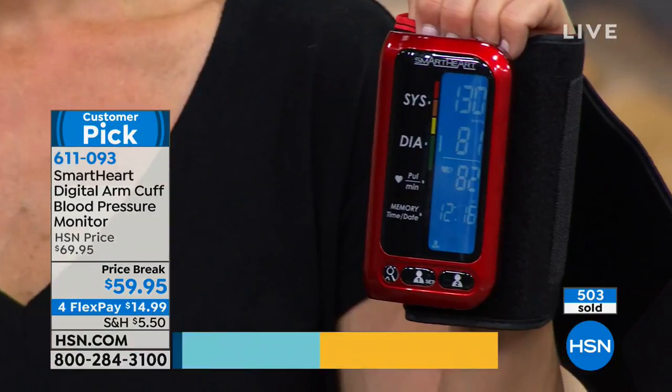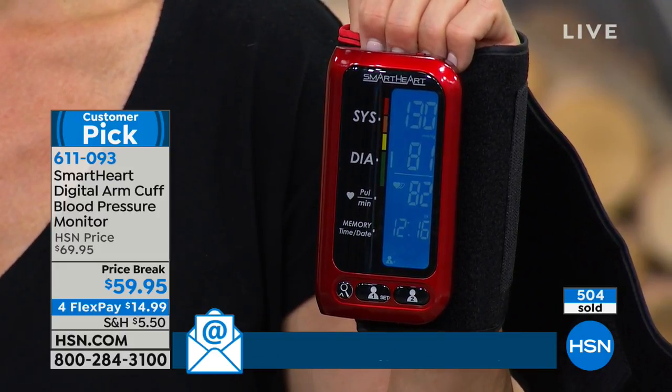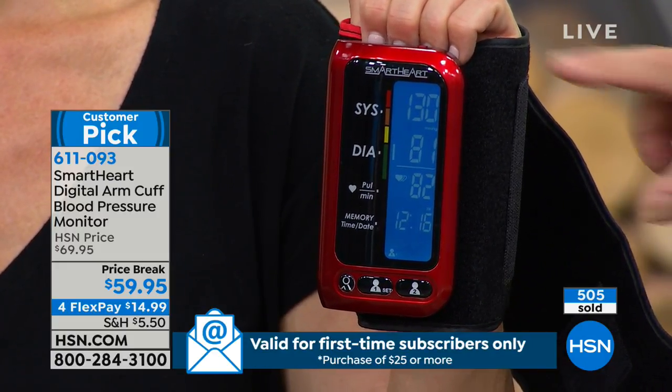When I was reading the reviews, people said things like, 'I like it that I could just take the unit to my doctor and show them what my readings are during the day.' There's something called white coat syndrome, which means you go to the doctor and you're so nervous your blood pressure goes up. So you're not really getting an accurate reading. When you have it at home, you take it a couple of times a day, get your average, and you're storing all that information — 250 readings for user one, 250 readings for user two.